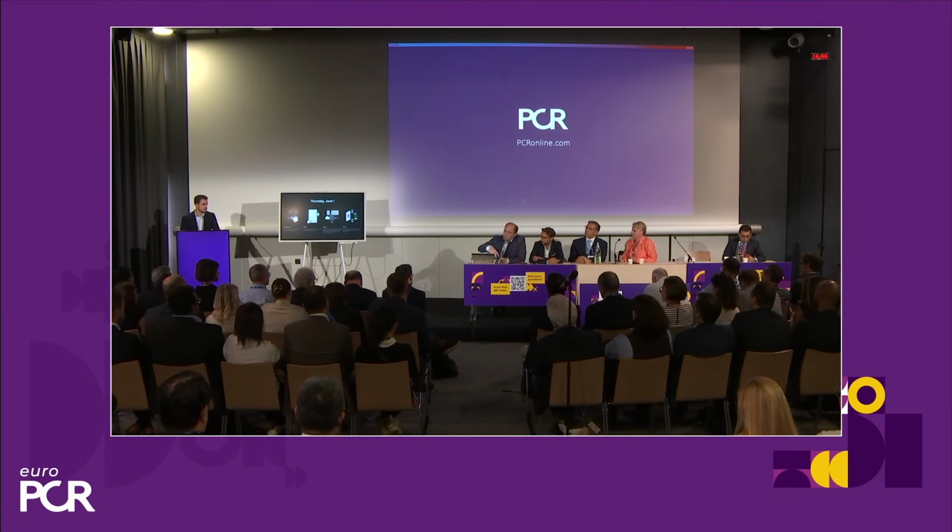So you are focused on the treatment of the MI patient, you treat the culprit lesion, you stabilize the patient, and the day after you can integrate the analysis with angio-FFR, angio-IMR, and you can decide if the patient comes back to the cath lab to treat the non-culprit lesion or goes home with a very good prognosis.